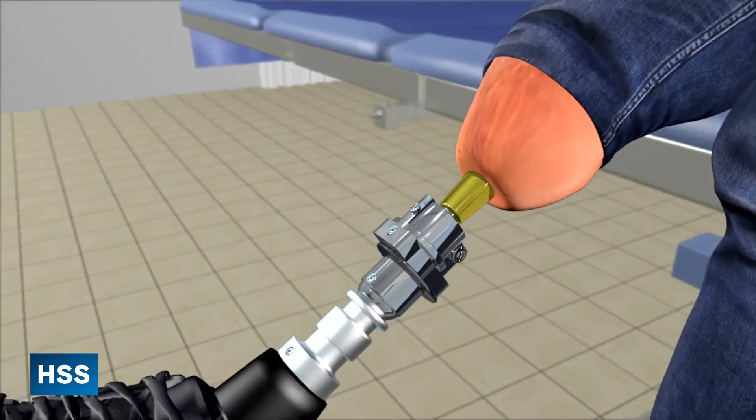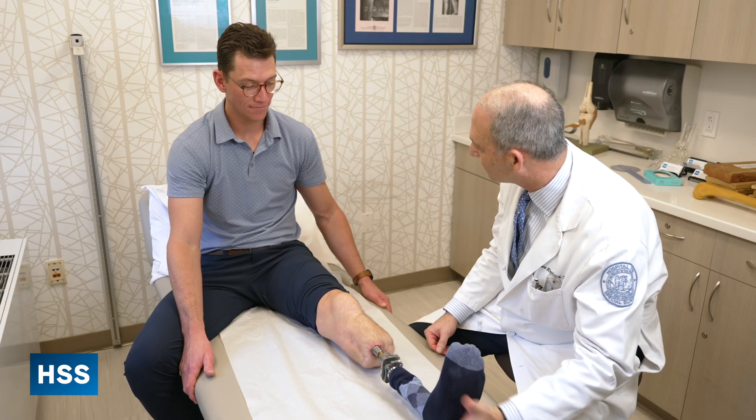Osseointegration is a direct skeletal connection between the prosthetic limb and the patient. That is an incredible advance because you accomplish two major things. One is you get rid of the socket. The socket's not comfortable — patients complain about it being too tight, too loose, sweaty, causing blisters and ulcerations. You make a quick turn and your body goes one way and your leg goes the other. The biomechanics of a socket are compromised — it doesn't provide the stability so that forces generated by the patient's muscles are fully executed by the limb.